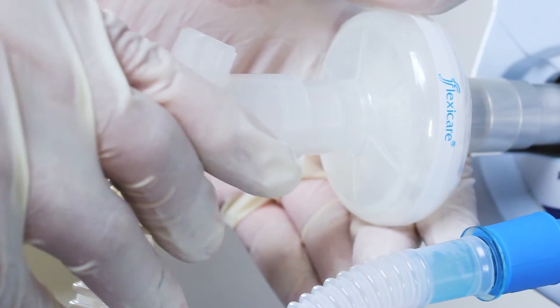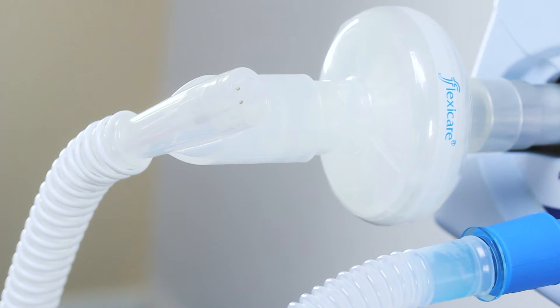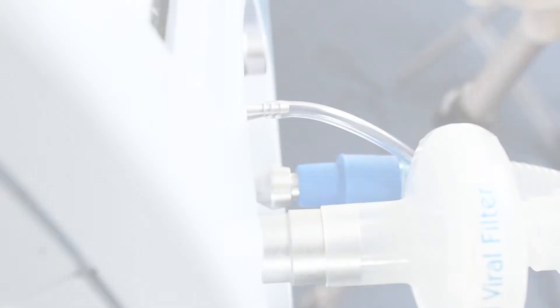Connect the elbow of the white expiratory limb to the ventilator expiratory port, or expiratory port filter if used. Connect the pressure line to the proximal airway port and the flow sensor to the ventilator.